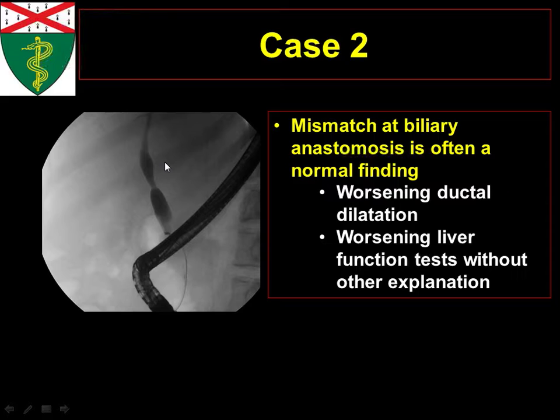Are the mismatched ducts or vessels more prone to stricture? I think so, but I don't know offhand. Ultimately, if you don't have anything that's connecting properly over time, it probably is more prone to strictures, but I'm not entirely sure.